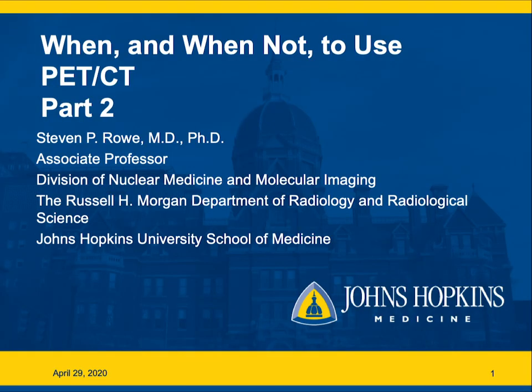Well, welcome back to the second half of the lecture on when and when not to use PET-CT. This half of the lecture is going to focus on applications of FDG outside of cancer, and then also on some non-FDG radiotracers that are either relatively new or newly FDA approved.